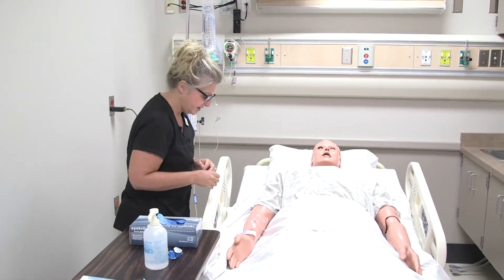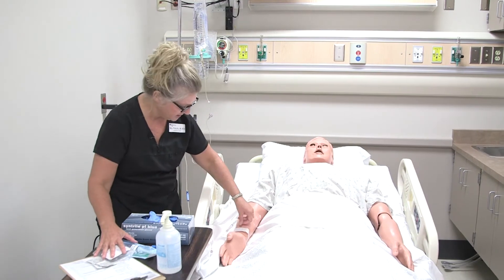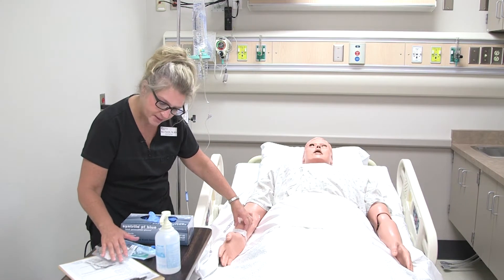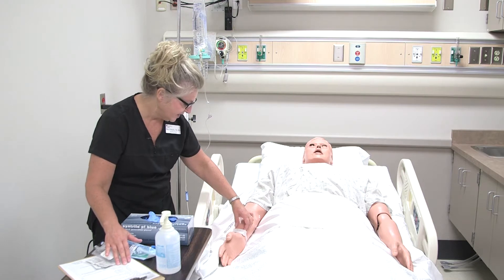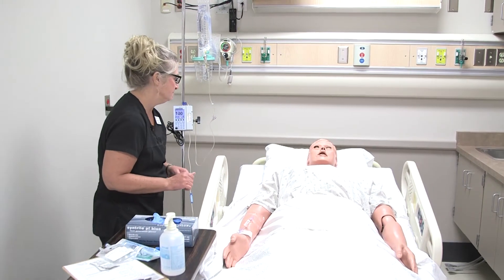Tim is fine. Okay, great. I just need to verify your full name and date of birth before we begin. Tim Pometlo, 7/10/64. Thank you very much. And do you have any allergies, Tim, that I should be aware of? No. Okay, great.